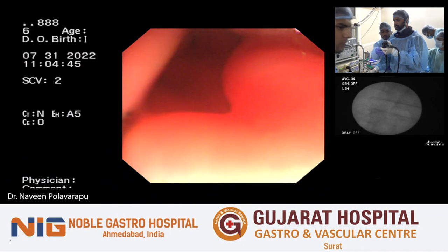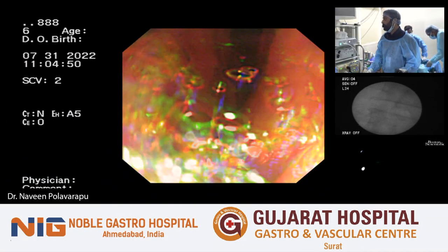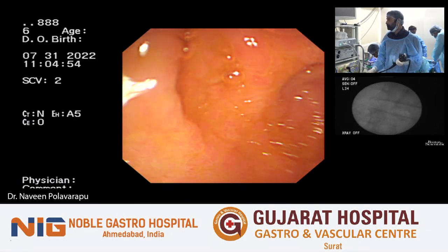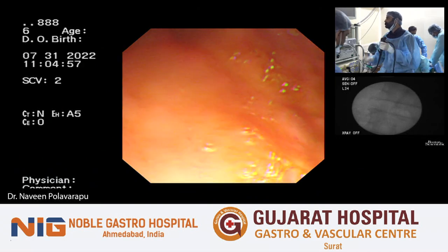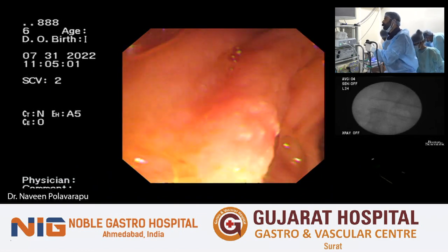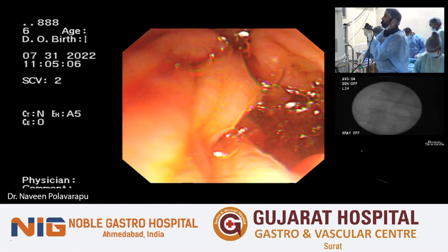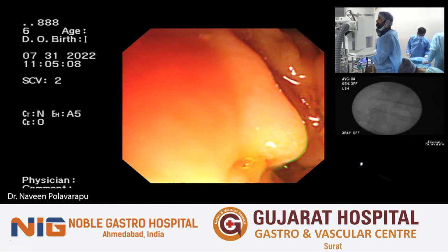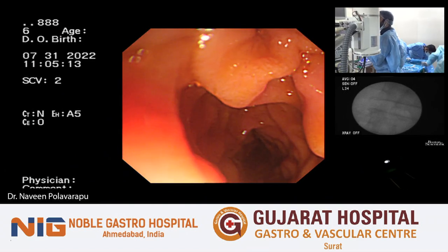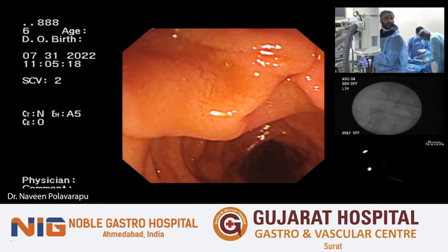Dr. Nilay, sir, is there any particular size in which we won't do cholangioscopy and lithotripsy for a CBD stone, any size? No, I don't think size is the hindrance. But it all depends on the stone and the CBD anatomy. So any size you can do it, but more than 3 cm, probably I would say 2.5, 3 cm, a surgeon would be having a better job. Because you would require more laser or EHL firing and probably 2 sessions.